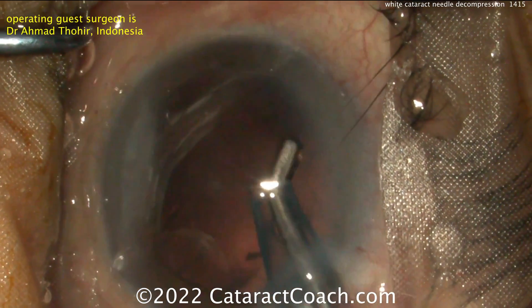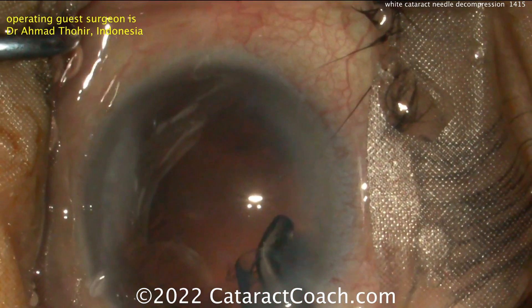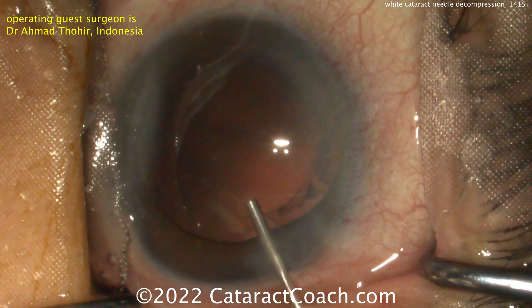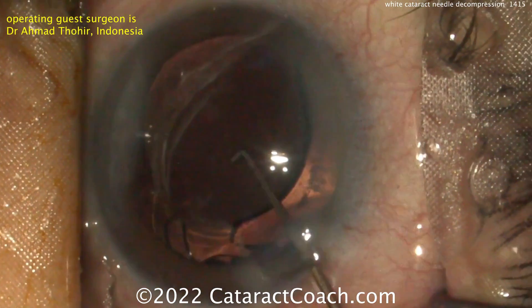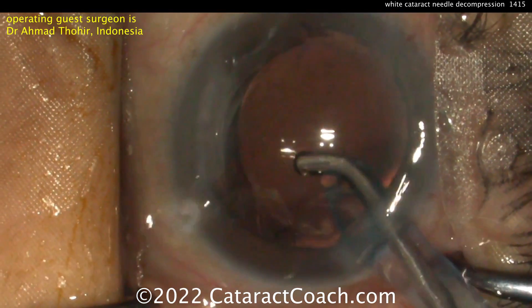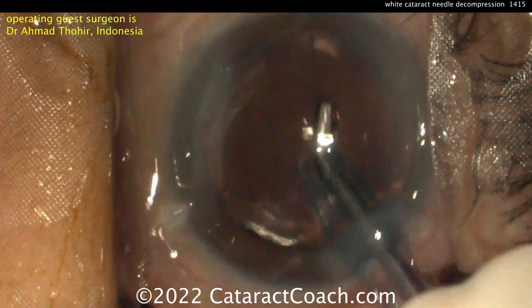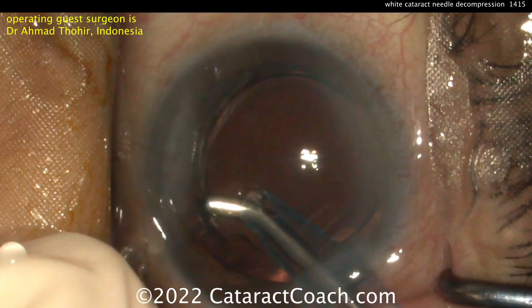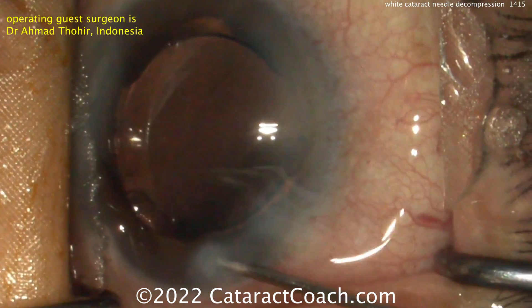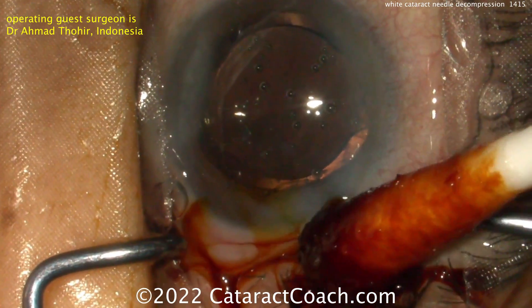Once the capsular bag is fully depressurized, getting the rexis done is really not much of an issue — it's pretty routine at that point. At the end of the case, everything else is going to be pretty routine: cleaning up whatever little lens material is left, filling the capsular bag, and putting the lens in the eye. A beautiful case — thank you to this doctor for sending the video in. We have featured needle decompression many times before on CataractCoach.com, where you'll find much more information than just YouTube videos and a much better search engine. Search for 'needle' or 'needle decompression' to find all those videos. It's a technique you absolutely must know how to do. Beautifully done — everything looks great.